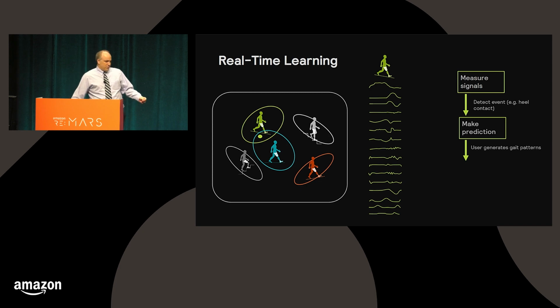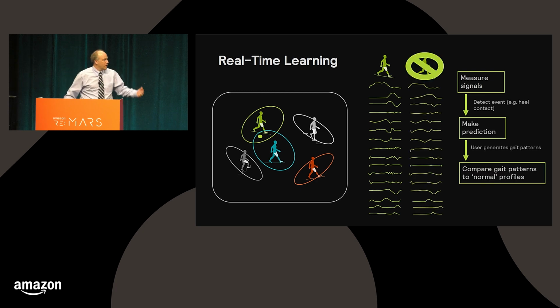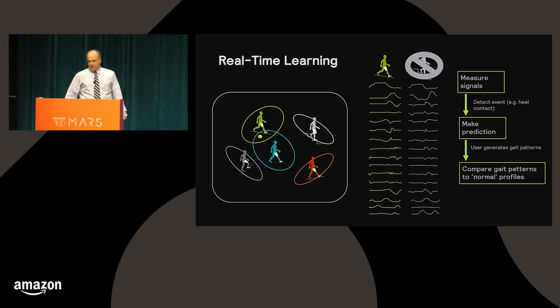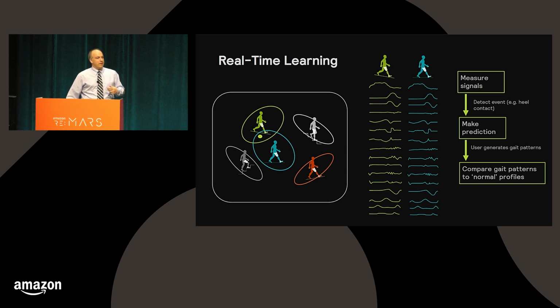What's generated by the user depends on that prediction. So if it does not predict the parameters for ramp descent, it's going to behave differently. So we compare these generated profiles to what would be normal from a textbook or from our experience with clean data. Nope, wasn't that one. Nope, wasn't that one. We made a mistake. This is what you actually did. So our prediction algorithm made a mistake.